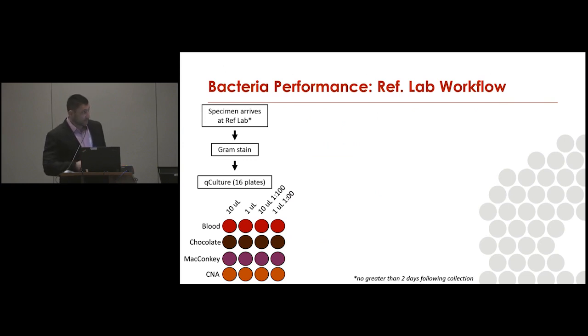So getting into these 15 bacteria that are reported with bins, how did we do the comparator testing there? Well, we did a very comprehensive quantitative culture. This was all done at MRI Global in Florida. Our sites were FedExing specimens overnight, refrigerated temperature, 3 days a week.